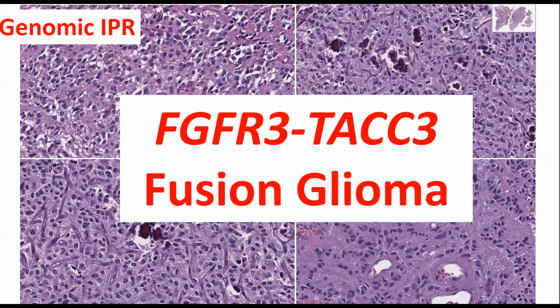Now, here's a problem with diagnostic radiologists and surgical pathologists. It's just in our nature. Anecdotally, based on our prior experience, we tend to overweight certain features with no scientific evidence. A person who's inclined to do that in this case would say, well, I know perivascular pseudo-rosettes, but it's always a spectrum, yada, yada, yada. Essentially, I'm going to ignore that, focus on all the other features, and sign it out as an oligodendroglioma, NOS, if I didn't have any data.